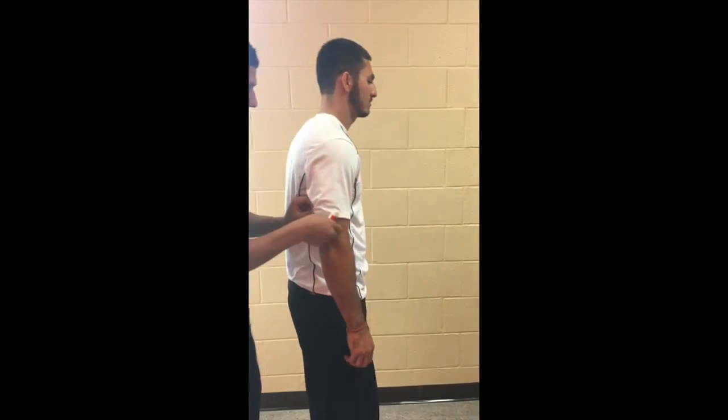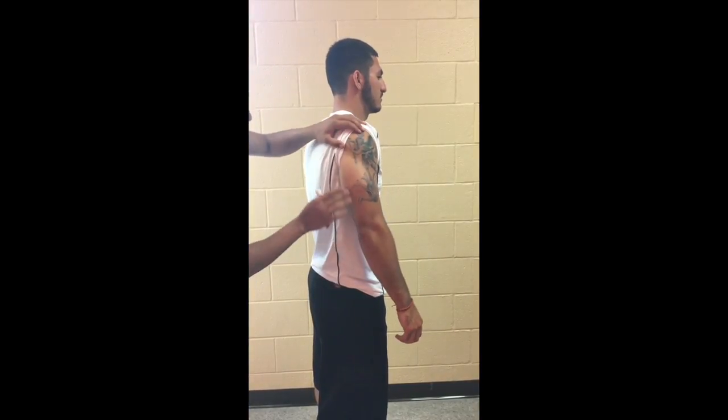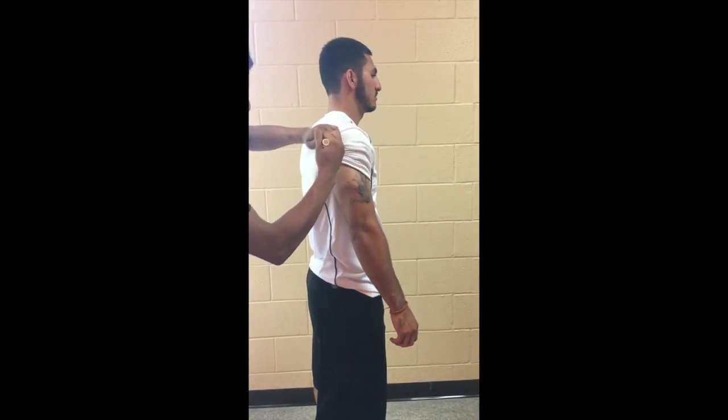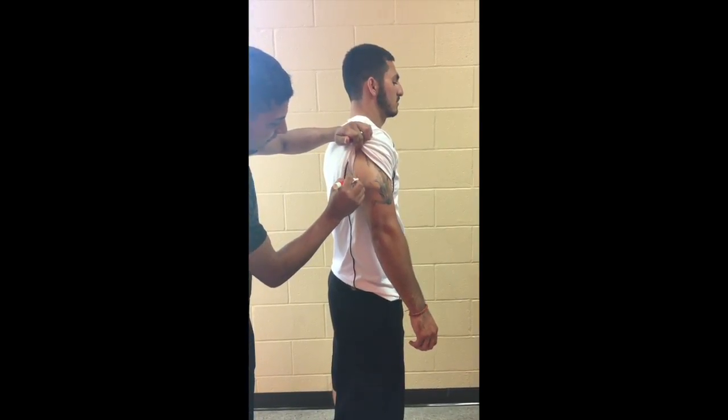The tricep site will be located on the posterior midline of the upper arm, halfway between the acromion and the olecranon process, with the arm held freely to the side of the body.